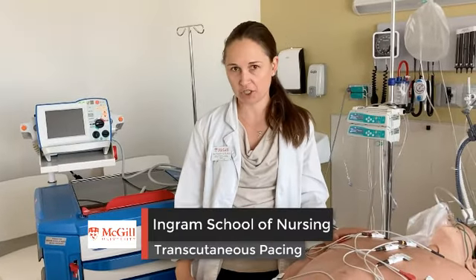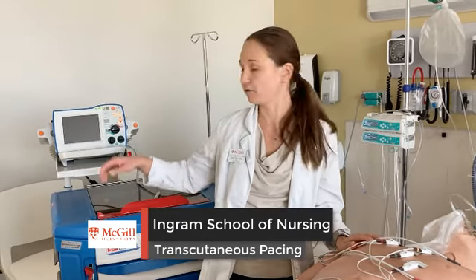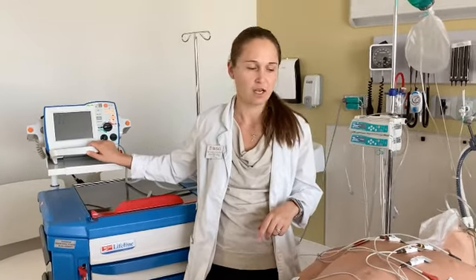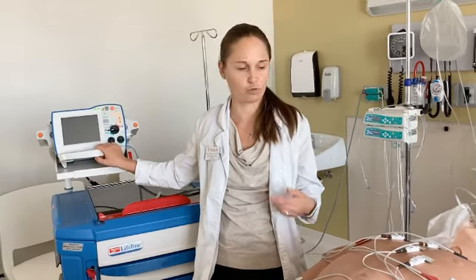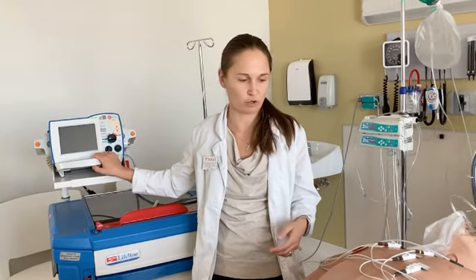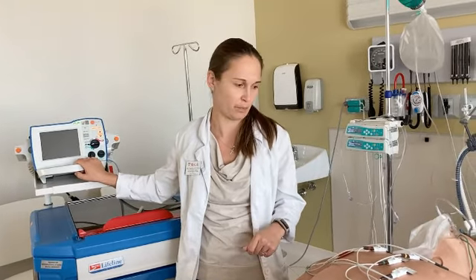So we've talked about defibrillation and cardioversion, and there's one more intervention that we can do with our defibrillator, and that is pacing. In this case, we're obviously talking about transcutaneous temporary pacing. This is something that would potentially help us stabilize a patient before a more permanent intervention, for example, the patient getting cardiac surgery or some sort of an implantable pacer.